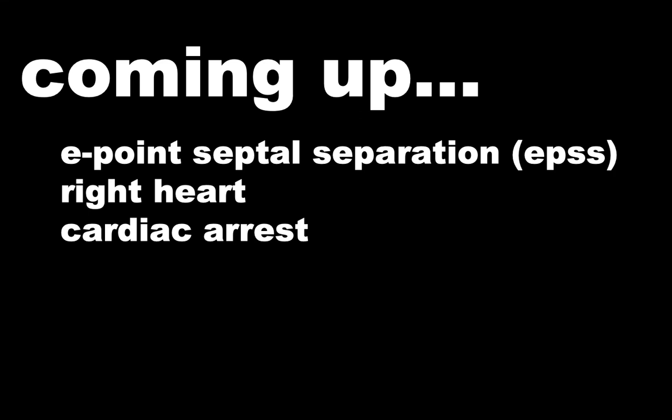Coming up in the advanced lecture, we're going to talk about the E-point septal separation, or the EPSS, which is a more quantitative measurement of a patient's left ventricular function. We'll also talk about the right heart and why the right heart matters and how to assess for right heart dilation. And last, we'll talk about ultrasound use in the setting of cardiac arrest.